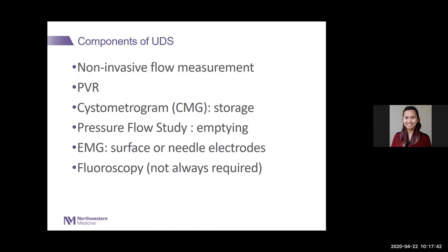So what are our components of urodynamics? So there's non-invasive flow measurement. We'll talk about pressure flows in a little bit. There's post-void residual, like we talked about, either we typically do it at the start of the procedure after they come into the room, they pee, and then you drain their bladder and see what's left.